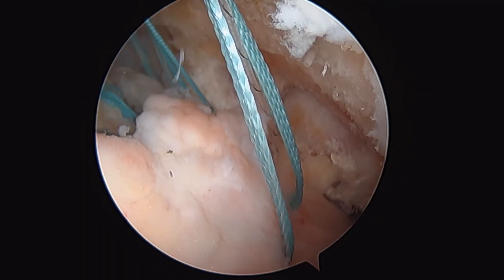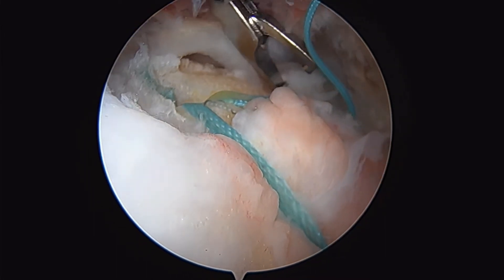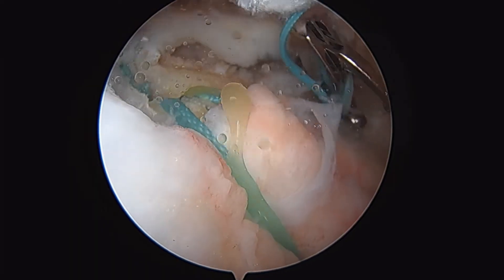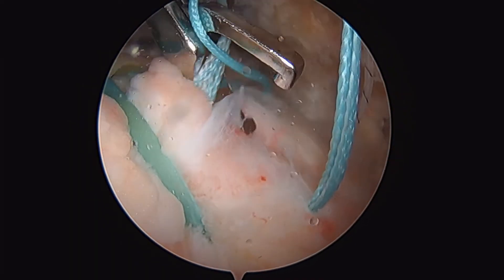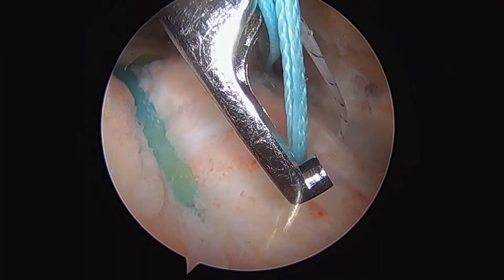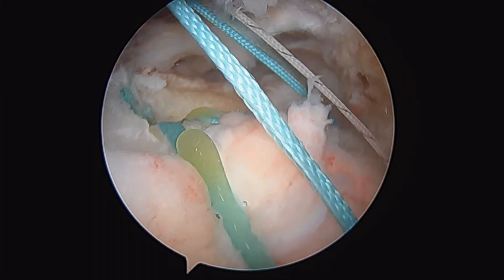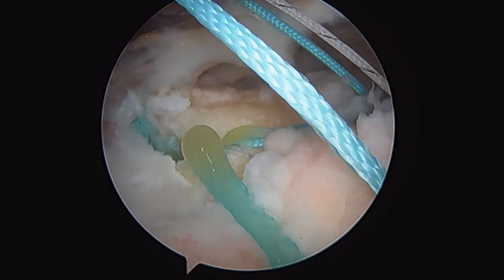So we'll show you how we did that here. We've taken four — and that's our first lateral row anchor. Now I'm going to come in here and grab the remainder of our sutures, so there should be another four. This is now our next four sutures coming out. We're going to combine those with our next lateral row anchor.